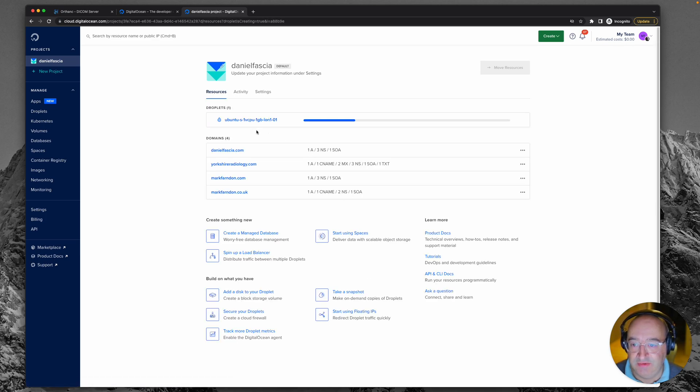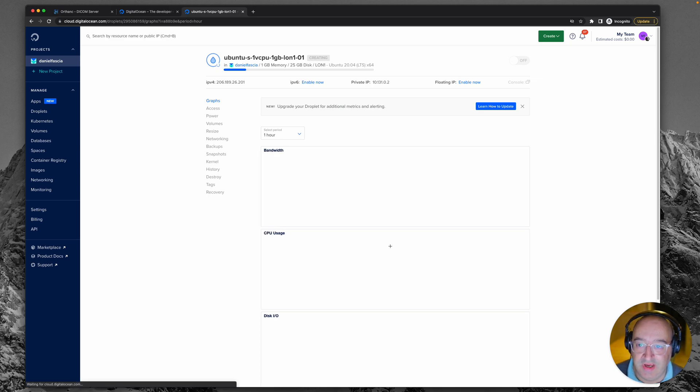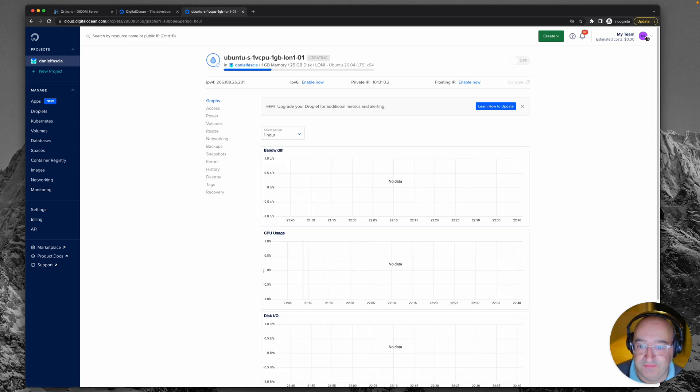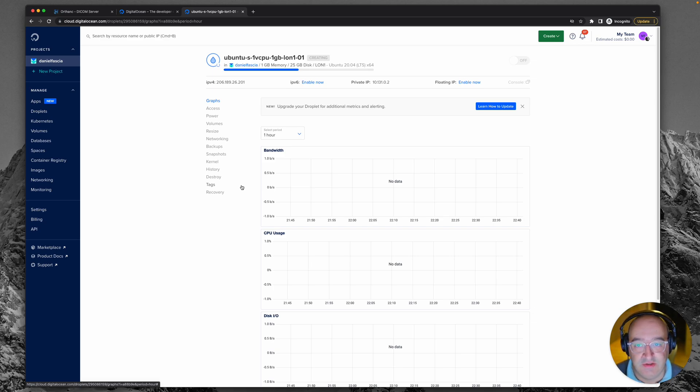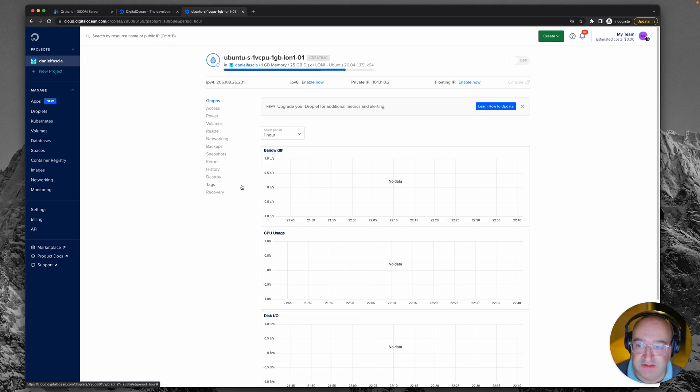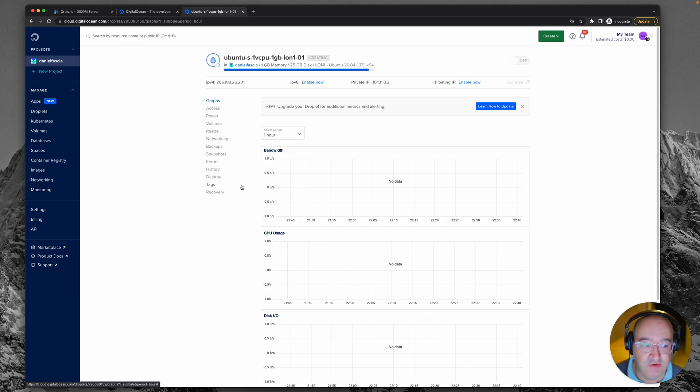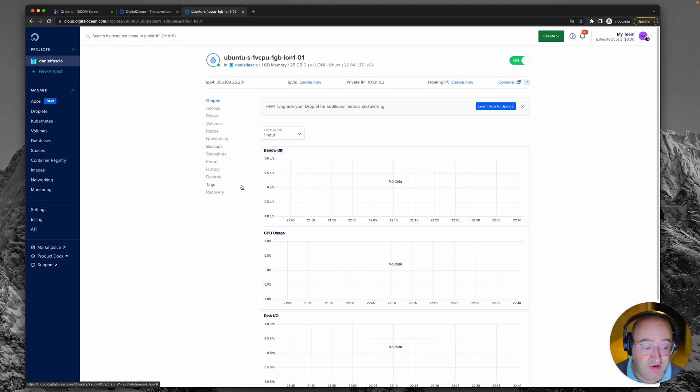So as you can see it does take a little while to spin away and make you your virtual private server. When it's done it's going to send you some credentials which you can use to log into it. Okay, droplet has been created, that means it's ready to go. That was quite fast wasn't it? Bear in mind we were watching that real time.